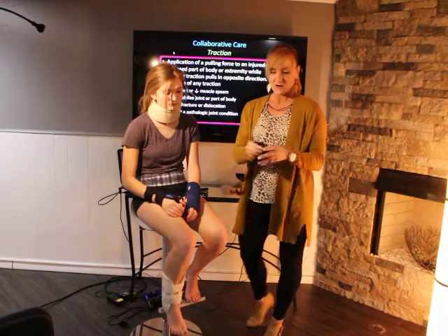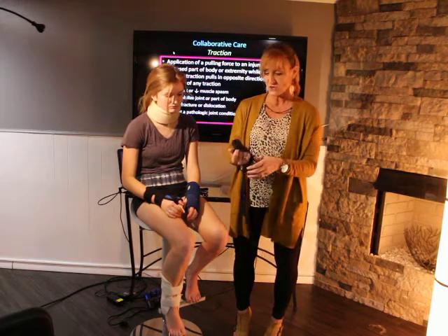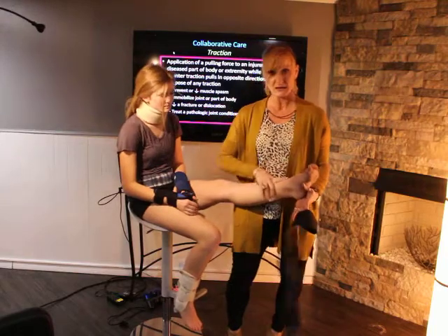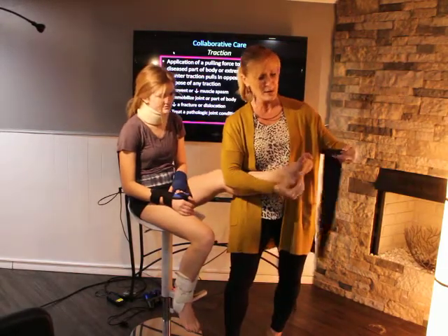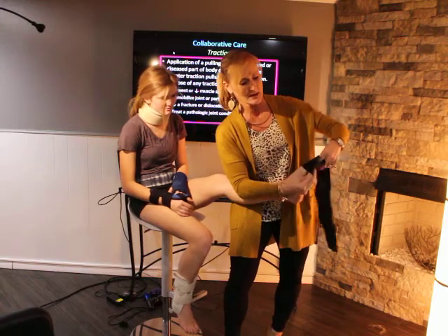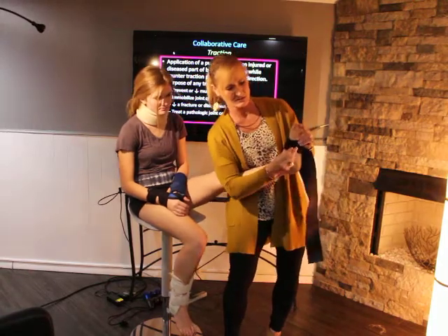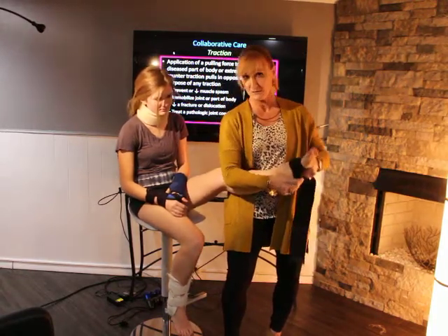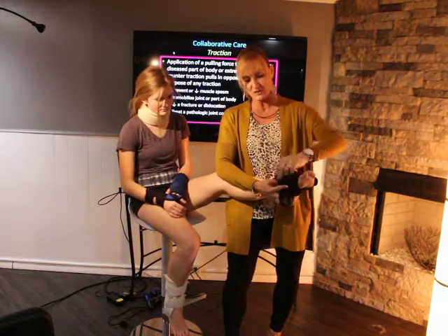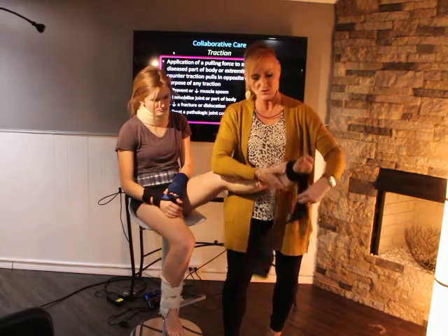They do make things that are much simpler for your patients who have sprains. So for example, if your patient has just a swollen ankle, sprained ankle, they're a soccer player, there's all kinds of things like this on the market. This is a nice one. This is like an ACE wrap that you would just slide right over the patient's injury, like their ankle or whatever, and then you can use this just like you would an ACE wrap. There's a little bit of rubber to it, and you just slide it around.